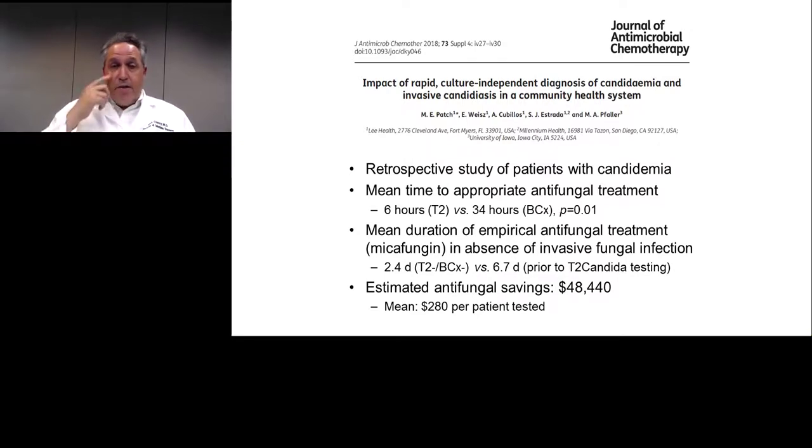They did a retrospective study of their patients with candidemia, and after instituting T2Candida, they had significant reductions in mean time to appropriate antifungal therapy among patients with positive results, 6 versus 34 hours prior to the introduction of T2.